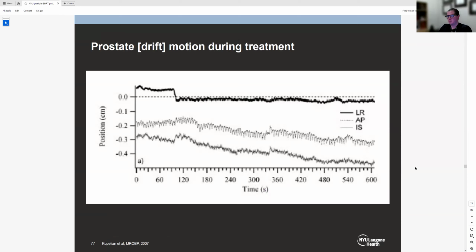And this is important because you can often see movement during a course of treatment. So, for example, if you're in the room and you cough, or you move your body a little bit because you have an itch, or you're trying to reposition generally, or there's a lot of motion inside of our own bodies that we can't control. Respiratory motion is the obvious one, but also your organs are kind of always moving around, especially in your gut. They're kind of drifting to new positions as you're metabolizing food, and you're filling up your bladder with urine, or you have a variety of things that can kind of create motion within your own body that aren't controllable. So that's why it's so important to be able to monitor where your target tumor is during treatment.